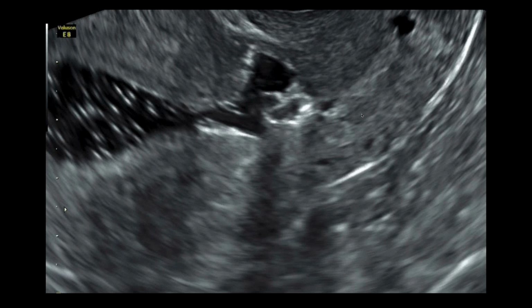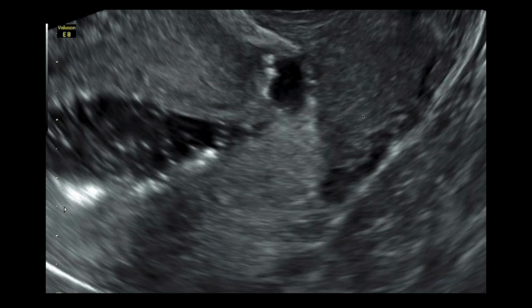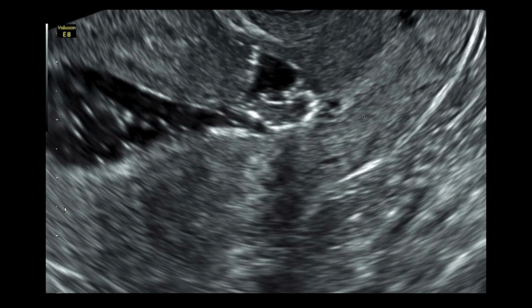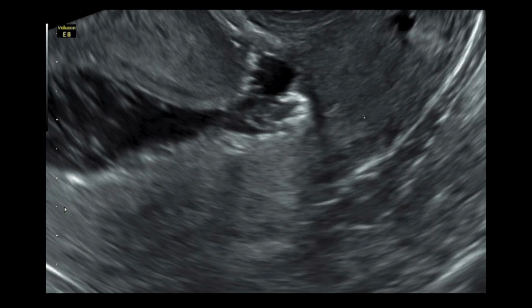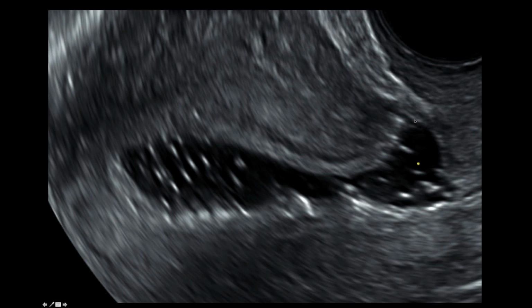Again, remember, ultrasound is a very dynamic exam. You need to use your probe just like you would if you were doing a manual exam. So we ended up flushing all of the clot out of that C-section scar defect, and this is what it looked like. Over here, you can see there's really not much myometrium left. And this is what it looked like on 3D. Here's the endometrial cavity at the top. The uterus is curved, so there isn't a mass here. This is just myometrium. And then the whole scar was open this wide.